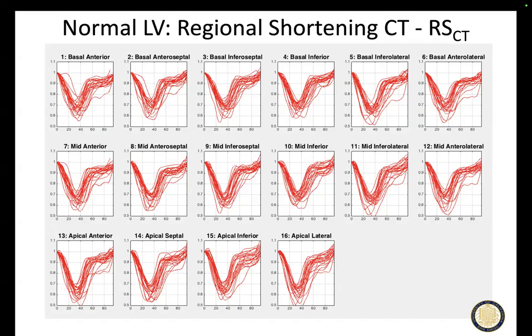And so what we did with those patients was analyze their left ventricular function, which also proved to be normal, and measure the curves at each location on their heart. Everybody starts at time zero. This is the R to R interval.